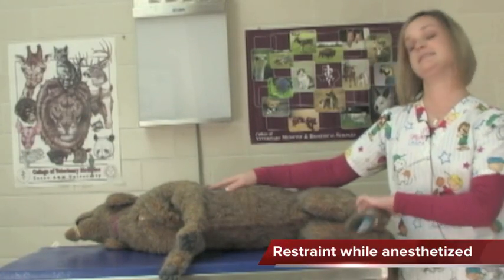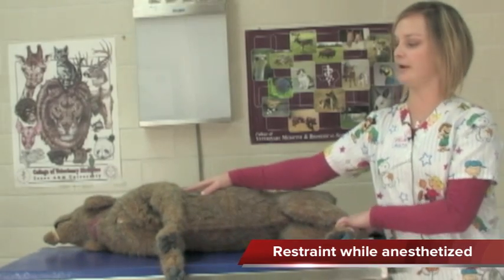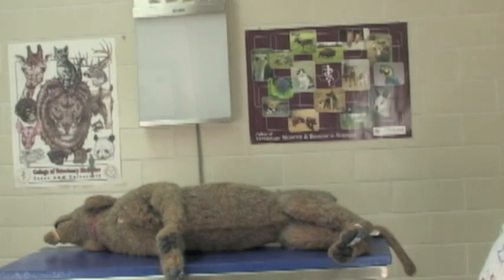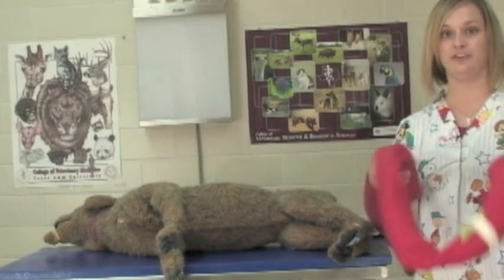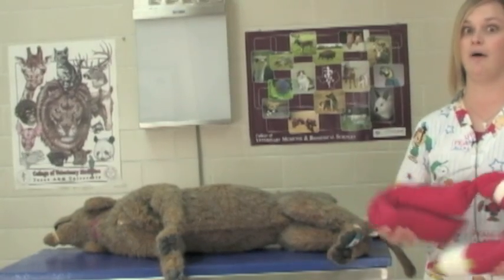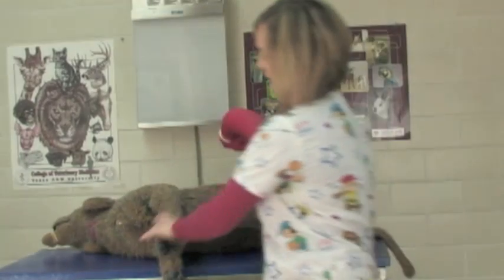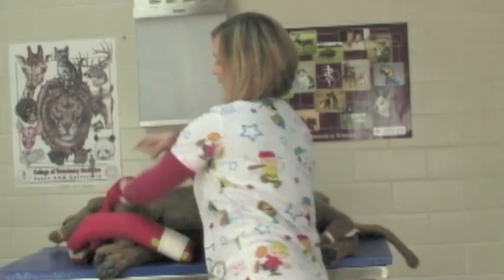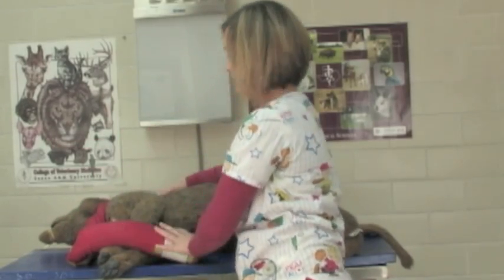When an animal is anesthetized, say for certain radiographs — most of the time post-ops — we try to keep people out of the rooms to reduce radiation exposure as much as possible. So we have little tricks of the trade that we like to use. Sandbags are extremely helpful. So instead of having someone hold the legs, you can simply sandbag the animals, such as so.